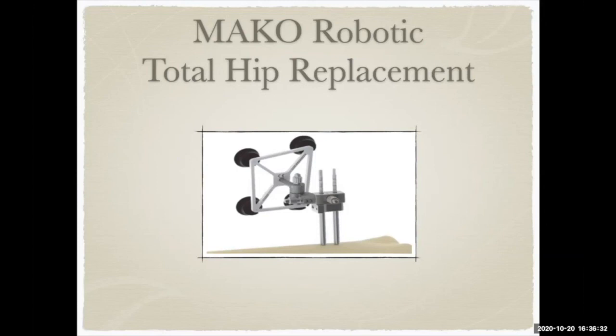So the arrays are the communicative device that communicates with the robot, so the robot can follow and track the patient as the patient moves in space. And of course, the patient may move themselves, because sometimes a patient, as they're breathing, might cough or something like that, and they might move. Or if I'm maneuvering the leg myself, of course, the pelvis and the leg change in position and space, and the robot has to accommodate that motion.